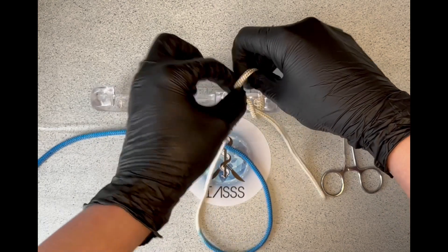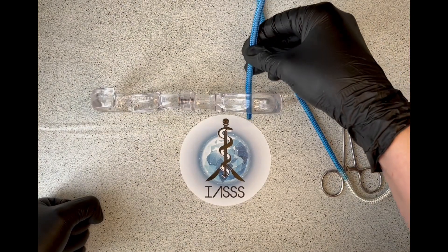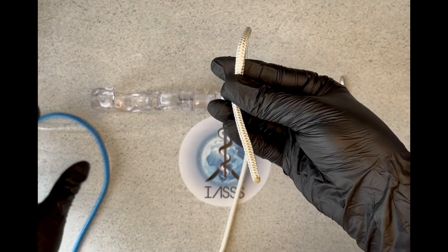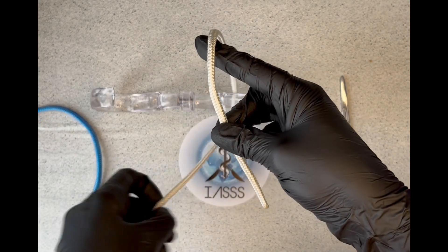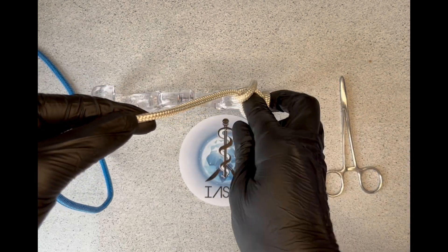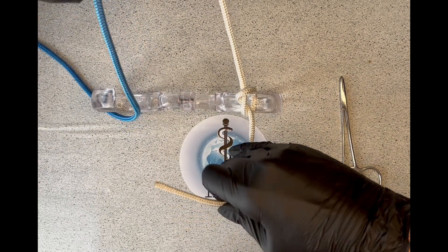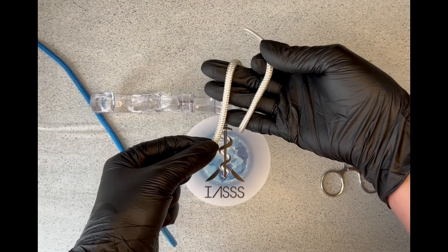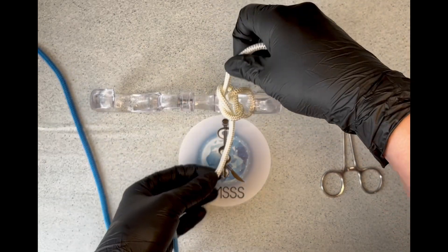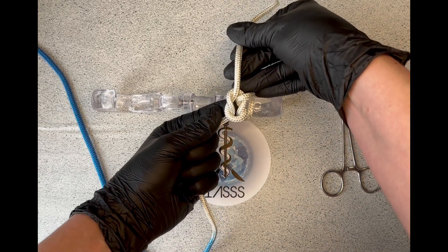To show you again: take your suturing material, place it through the tissue, pull it towards yourself. Take the free end between your middle finger and thumb, extend your index finger and bring the suturing material up into a four. Take your index finger around and thread the loop through, then pull that towards yourself. Flip this hand over and place your other end in parallel to it. Middle finger goes over and under, extend that away from yourself, and that brings you into your beautiful reef knot. That is the reef knot completed.